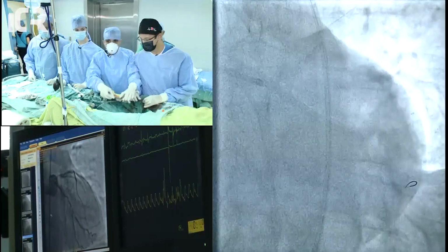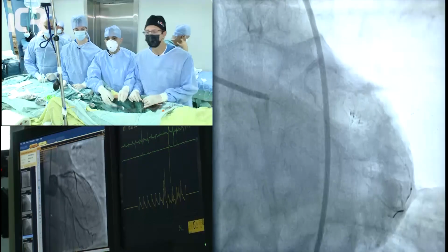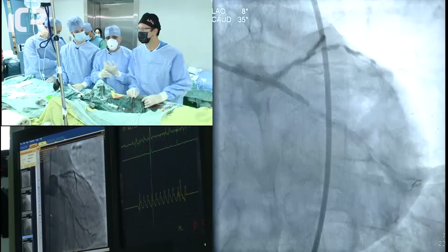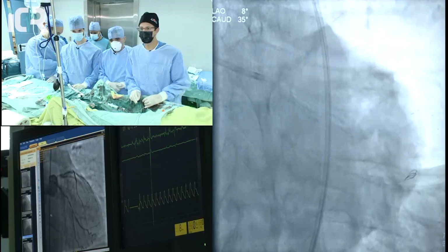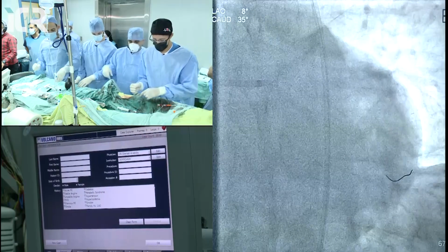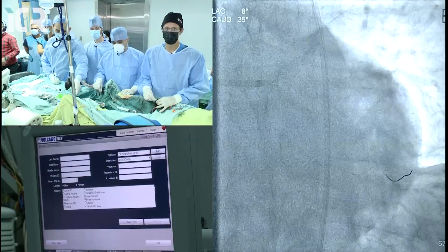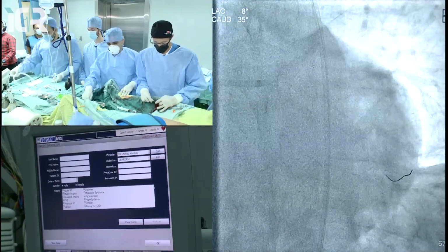That's nice. But maybe stent opening will be very difficult. Yes. So we can do IVUS of this vessel before we decide to go for PTCA only, or do rotablation or plaque modification. So we prefer to do IVUS of the vessel first to see whether this vessel needs plaque modification, rotational atherectomy, or only high pressure balloon inflation for pre-dilatation.